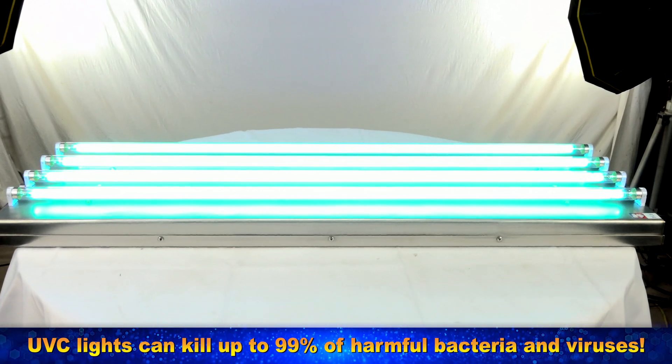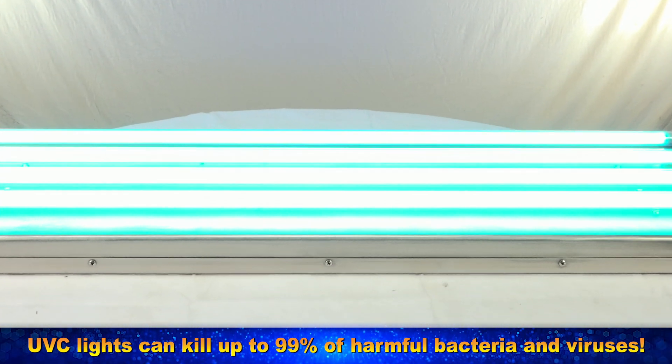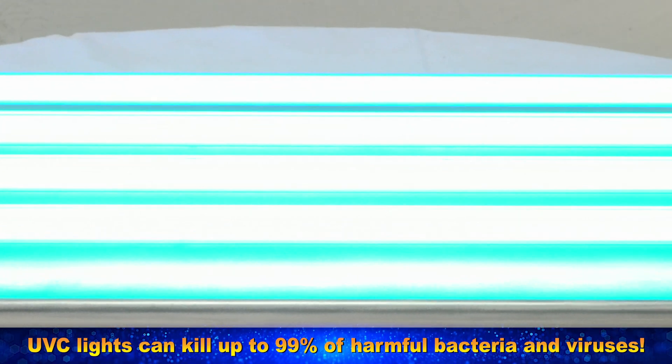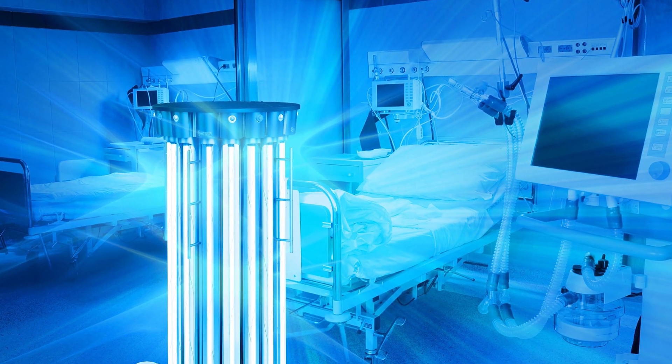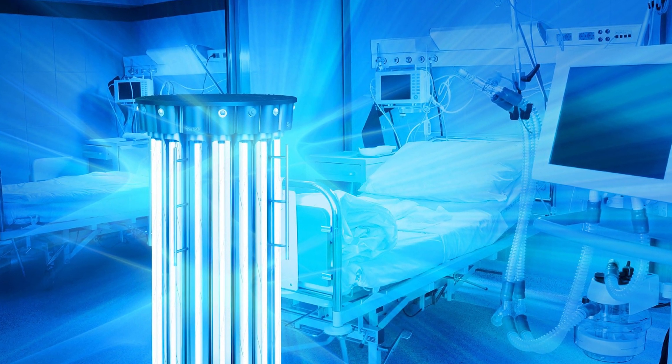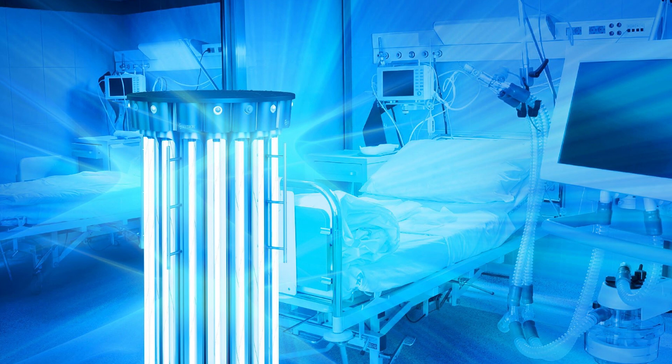UVC lights can kill up to 99% of harmful bacteria and viruses, including the COVID-19 coronavirus. According to the latest guidelines on the diagnosis and treatment of the coronavirus released by the National Health Commission, the virus is sensitive to ultraviolet light and heat.